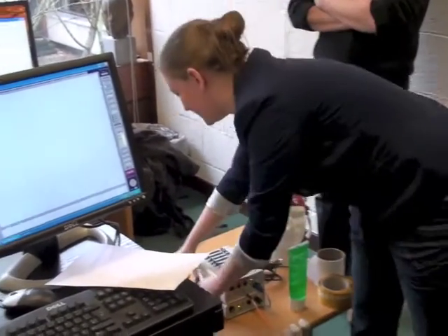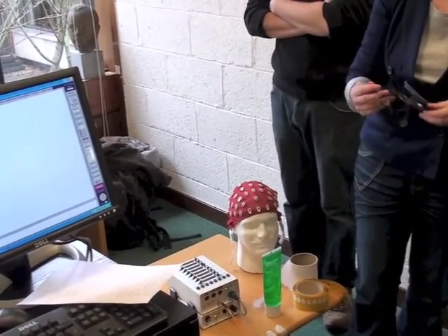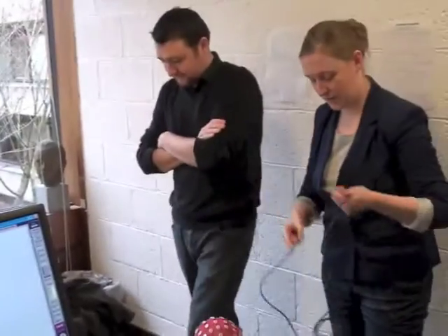Okay, so that's connected to that. And now, seeing as this is the kind of central communication box, it also has to get connected to this computer. So this is pretty much connected to everything. That wire you put in was to the presentation computer, yeah, the big wire.